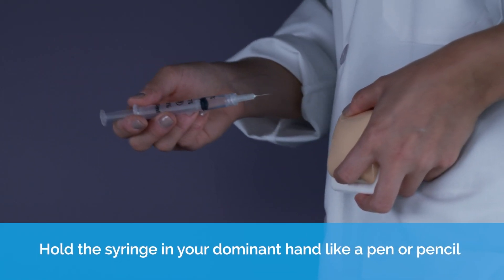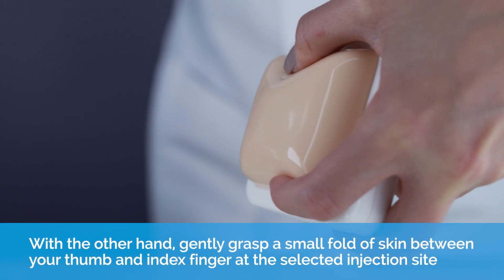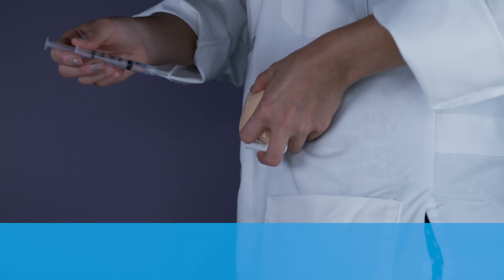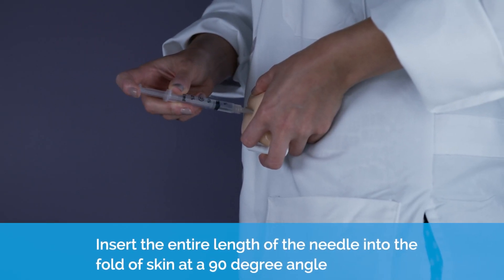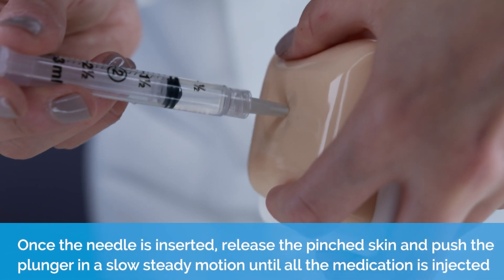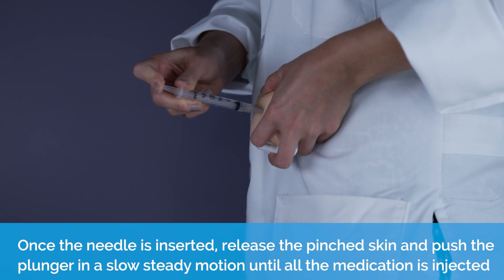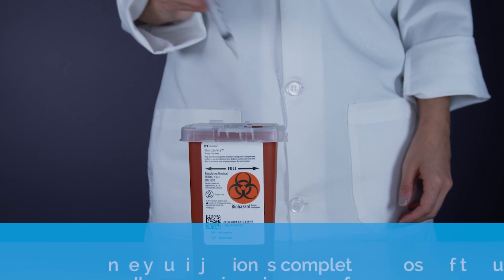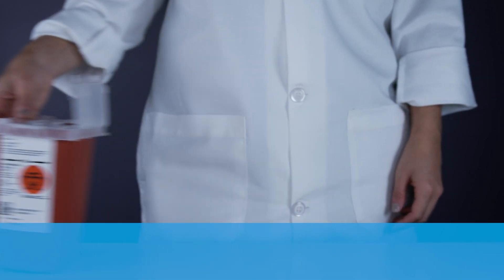Hold the syringe in your dominant hand like a pen. Insert the entire length of the needle into the fold of skin at a 90 degree angle. Once the needle is inserted, release the pinched skin and push the plunger in a slow, steady motion until all of the medication is injected. Gently withdraw the needle. Once your injection is complete, dispose of the used needle and syringe in your safety container.